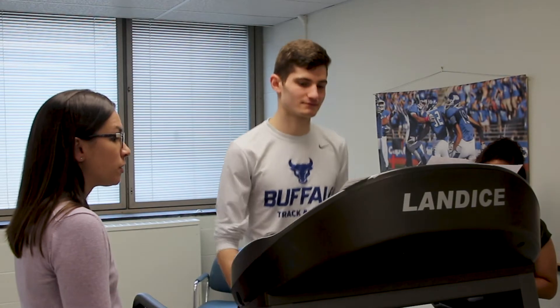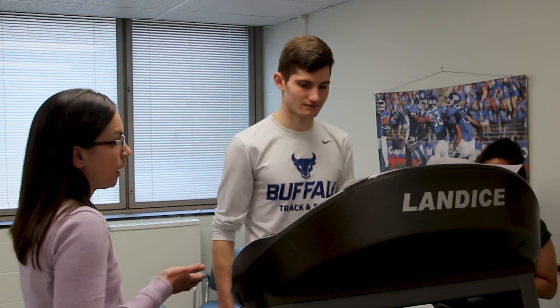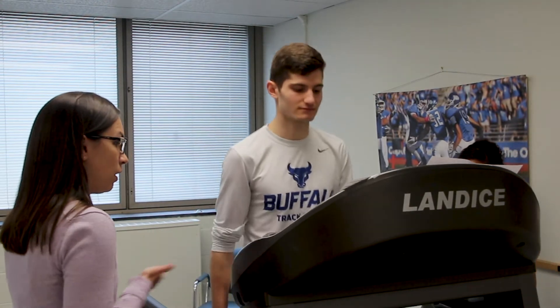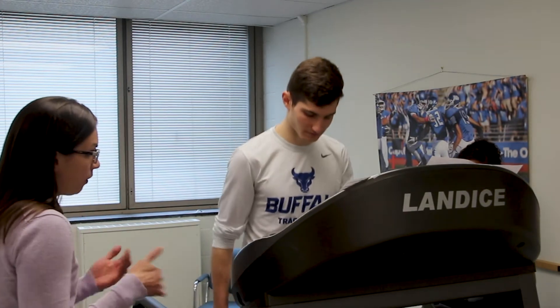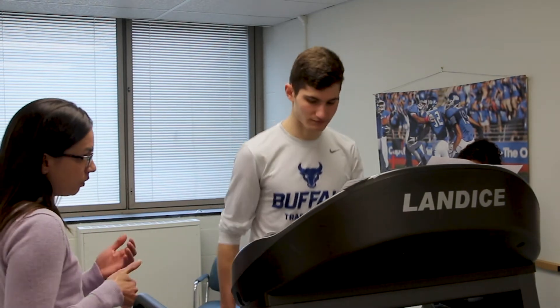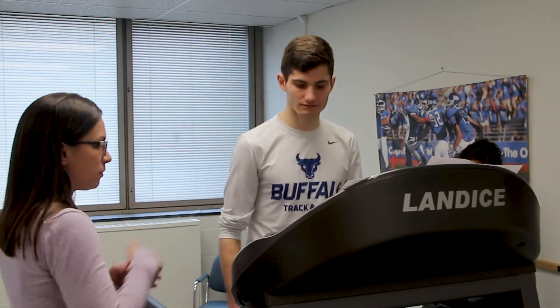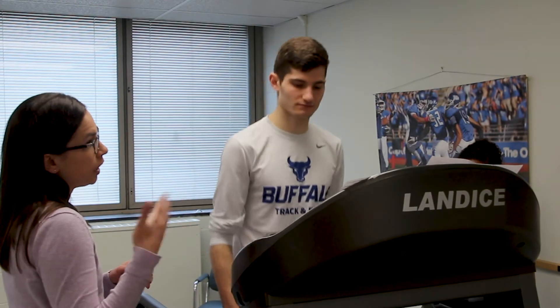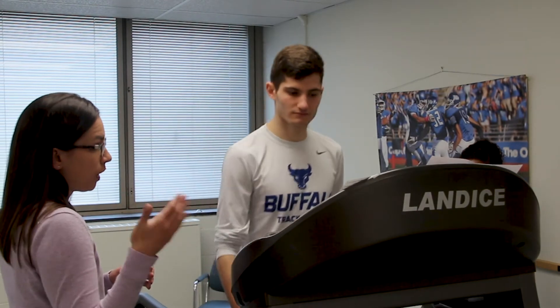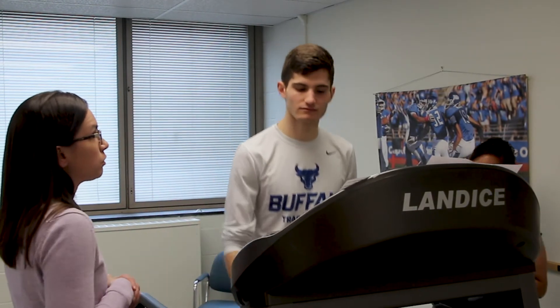As our test progresses, make sure you're giving honest answers about how you're feeling. If you feel unsteady on the treadmill, that is something to include in how you're feeling with your symptoms. If you feel like your lungs and your legs are starting to give out a little bit more, that would be more of our perceived exertion scale.